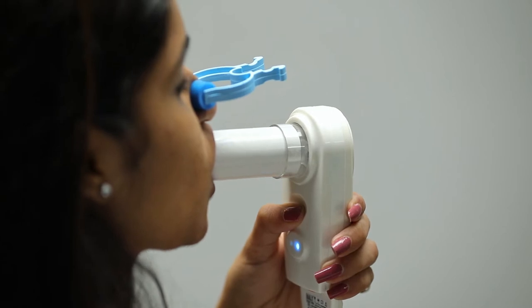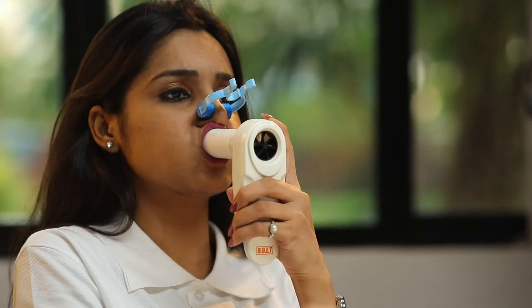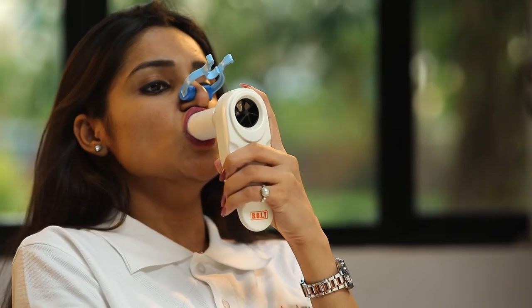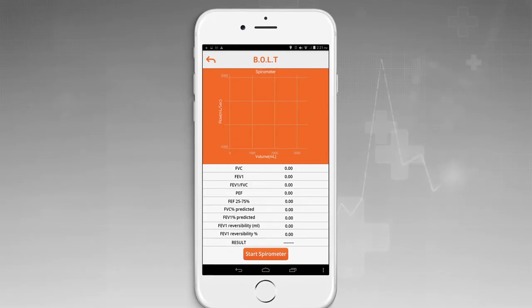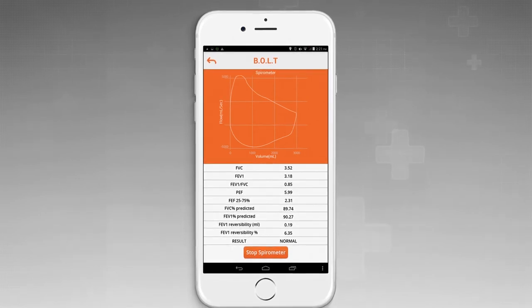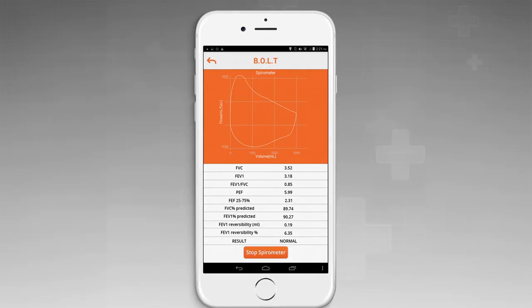Insert the mouthpiece of the spirometer. Now exhale completely into the spirometer mouthpiece and then inhale to the maximum. If the process was successful, the application would display the readings. The results are displayed in the application screen in 4 to 5 seconds.